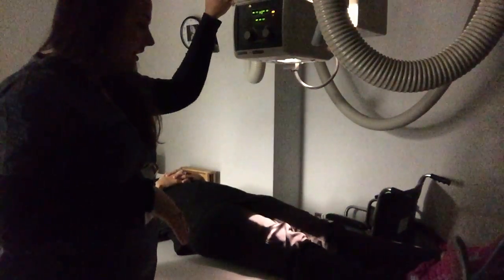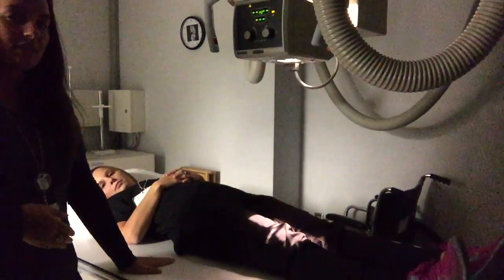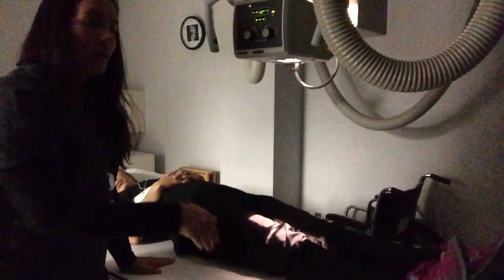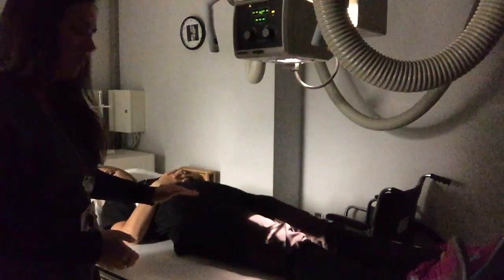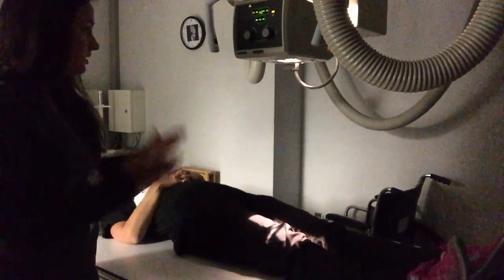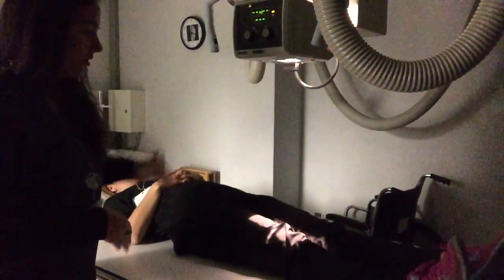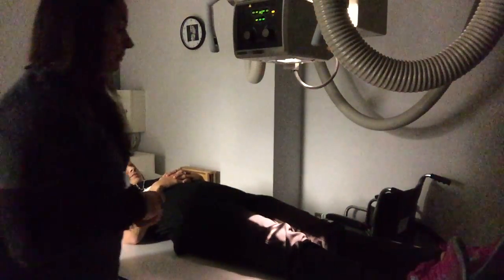Now, when we're doing your AP knee, you're going to take some consideration into the size of your patient as to how you're going to manipulate your tube. As your book says, if the patient's measurement from their ASIS to the tabletop is less than 19 centimeters, then we are going to be angling towards the feet. But if they are a standard, what we call average size patient, which is a measurement of 19 to 24 centimeters, then we would just go straight on with our tube for this projection. And if they're 24 centimeters or above with their measurement, then we will angle up 5 degrees towards their head.